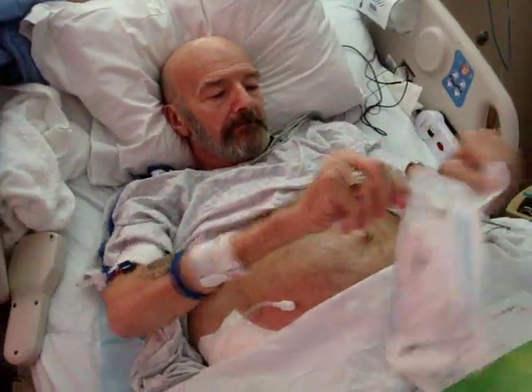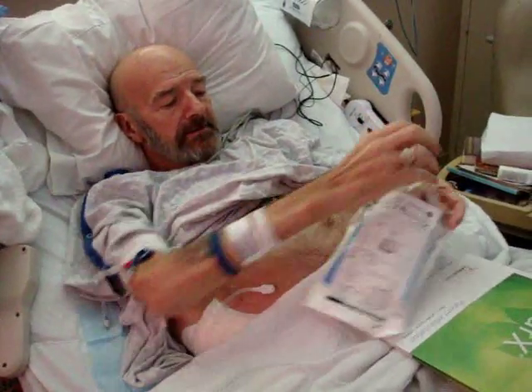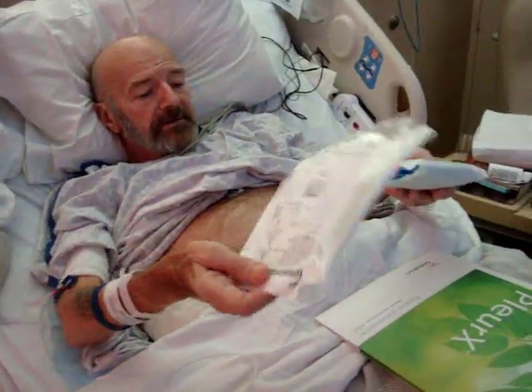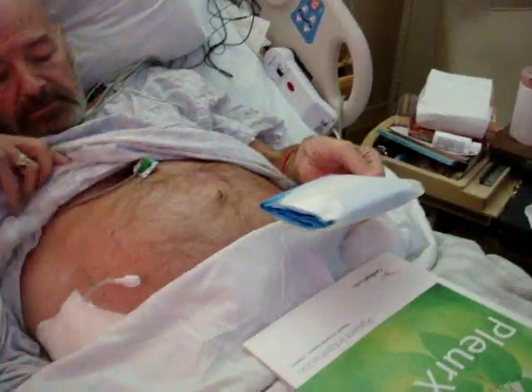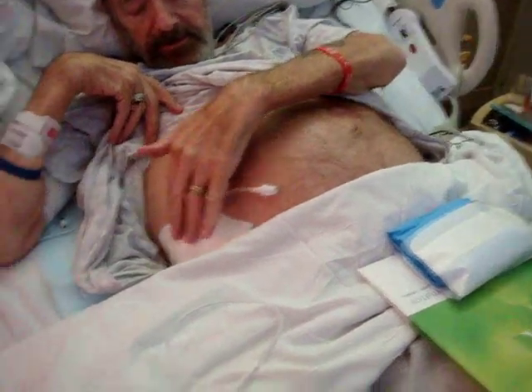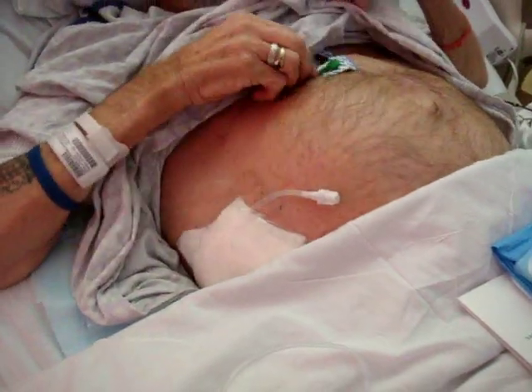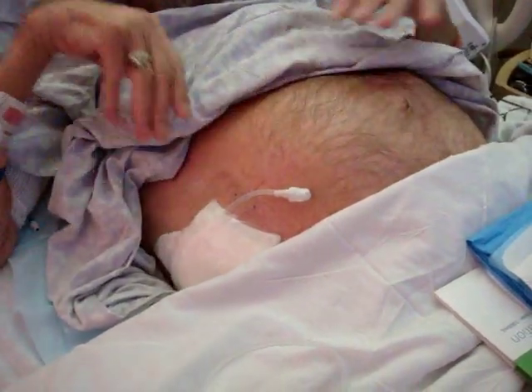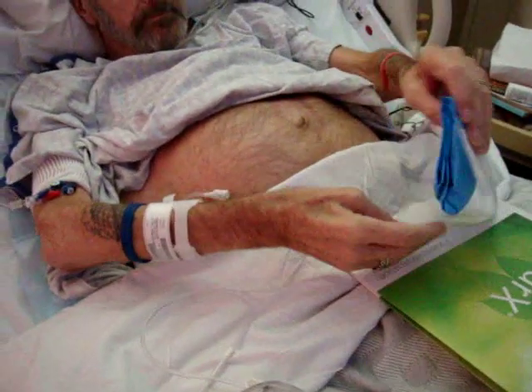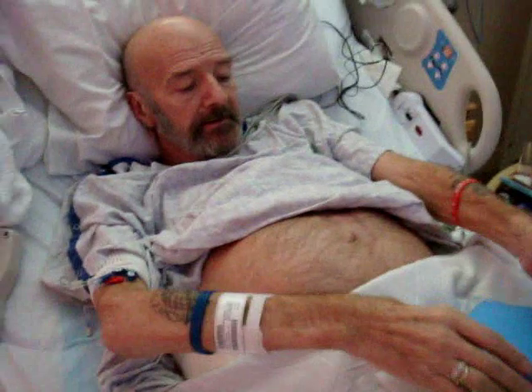We won't need all of this kit in here, because some of it is for changing the dressing, and we have had to change the dressing before because it was leaking. But I've managed, I hope, to get it before it gets to that point — so it's not leaking. This is the outer cover that you see there, which we won't need today.